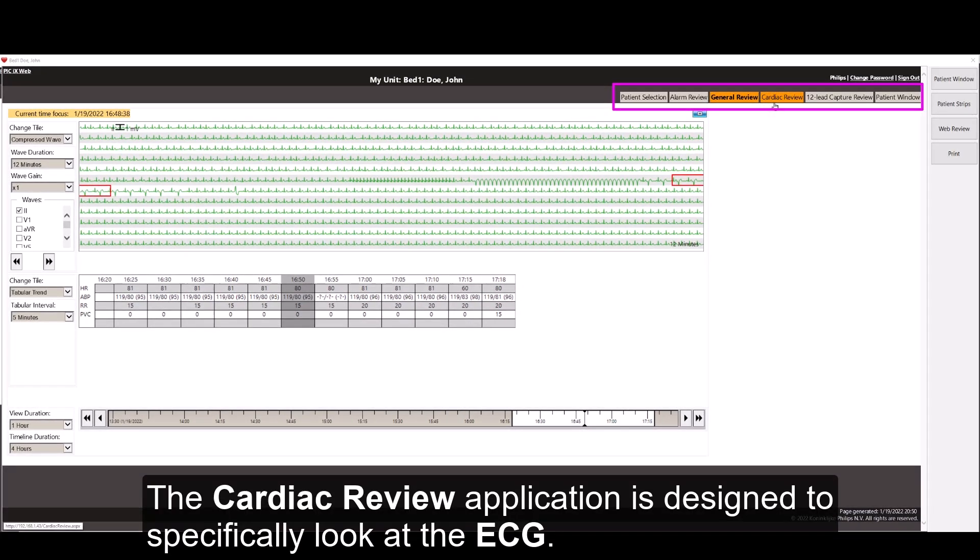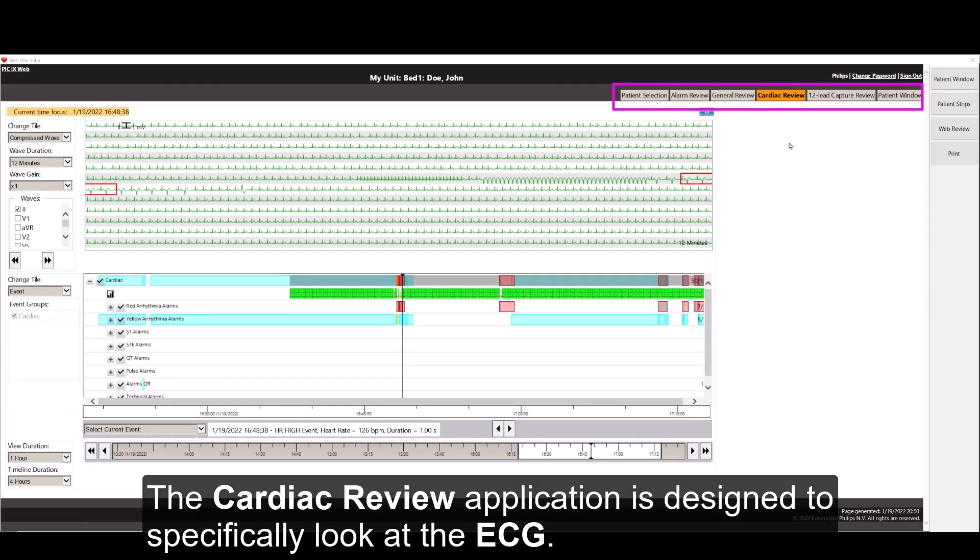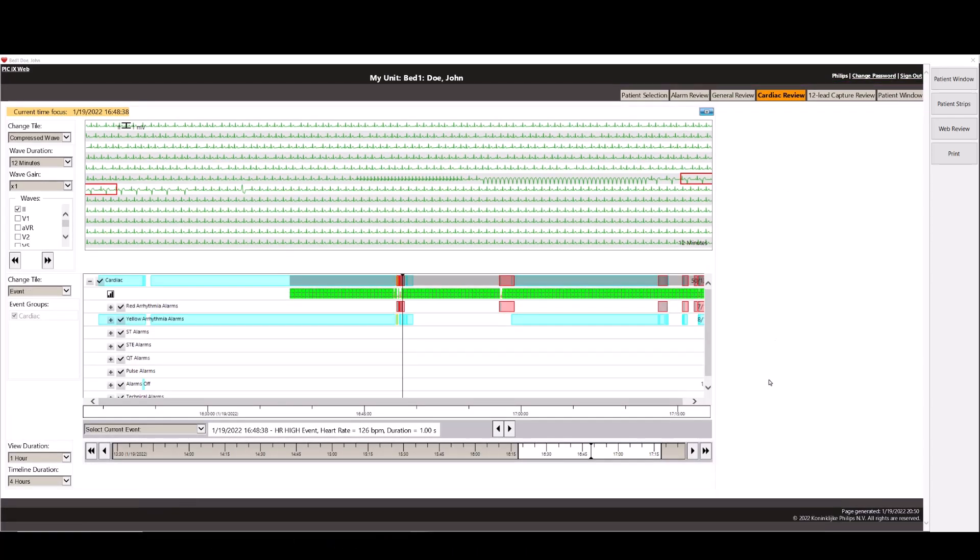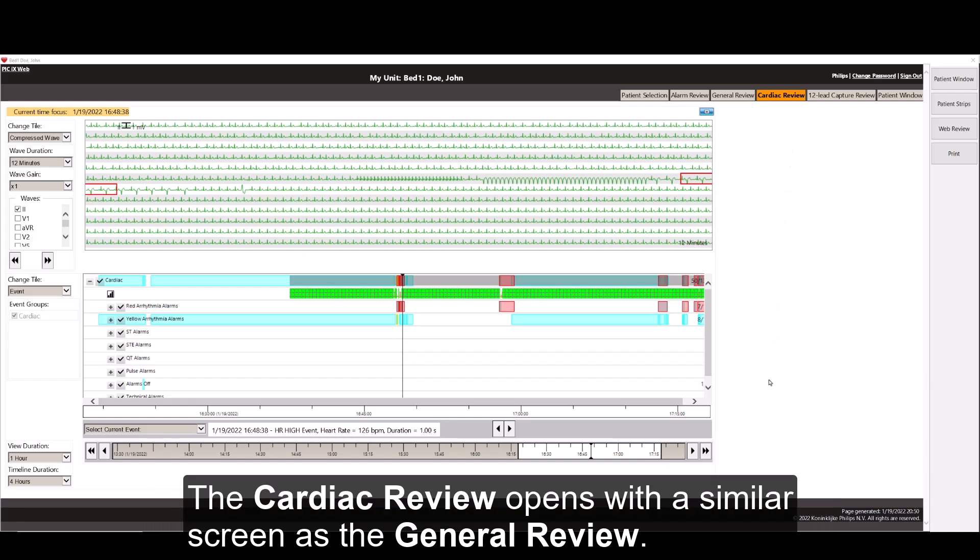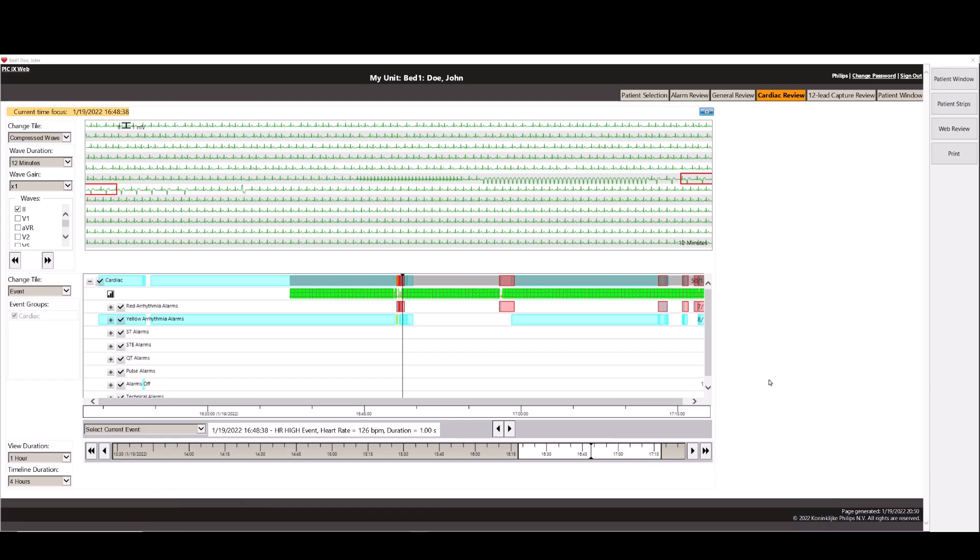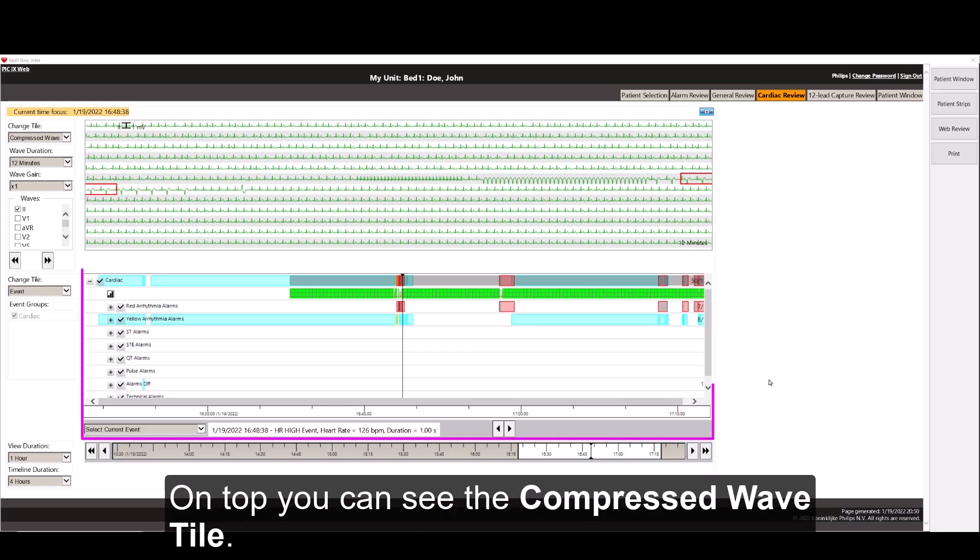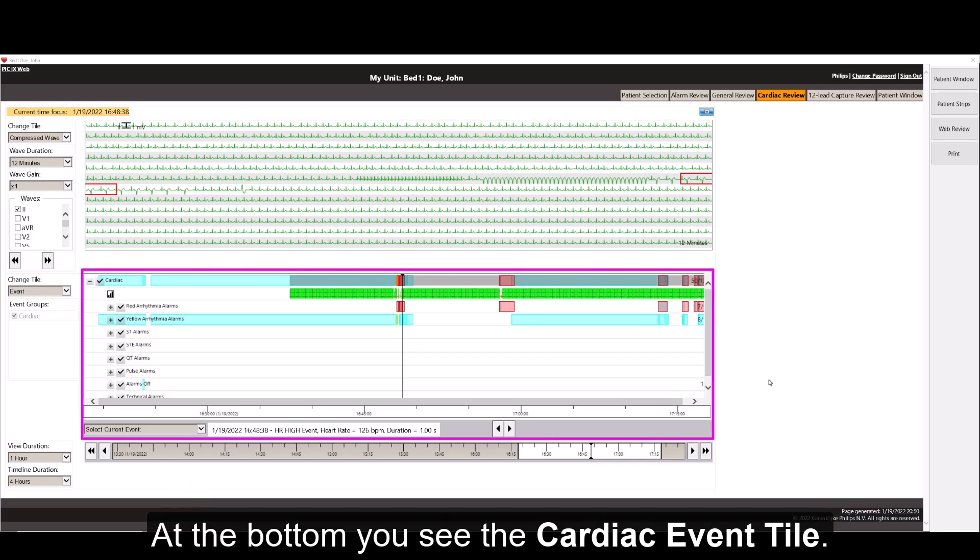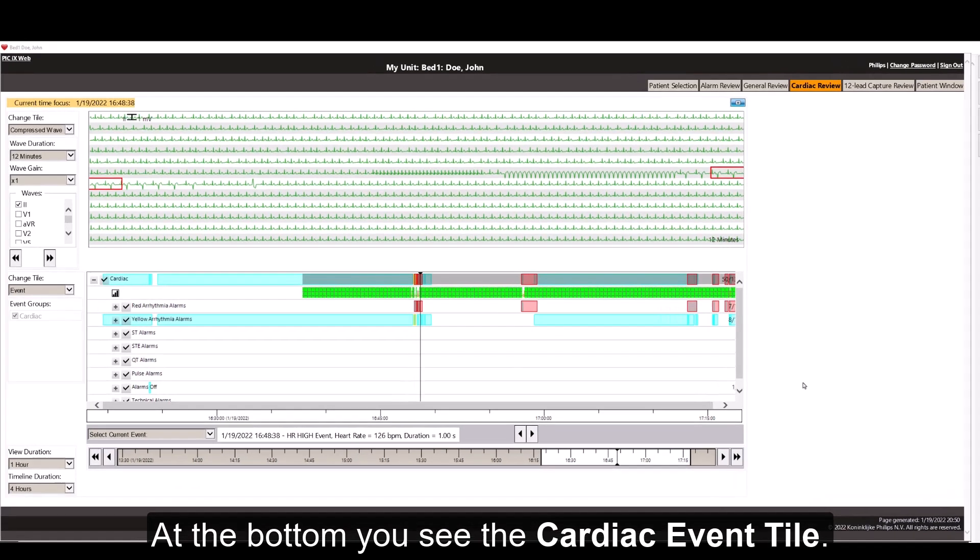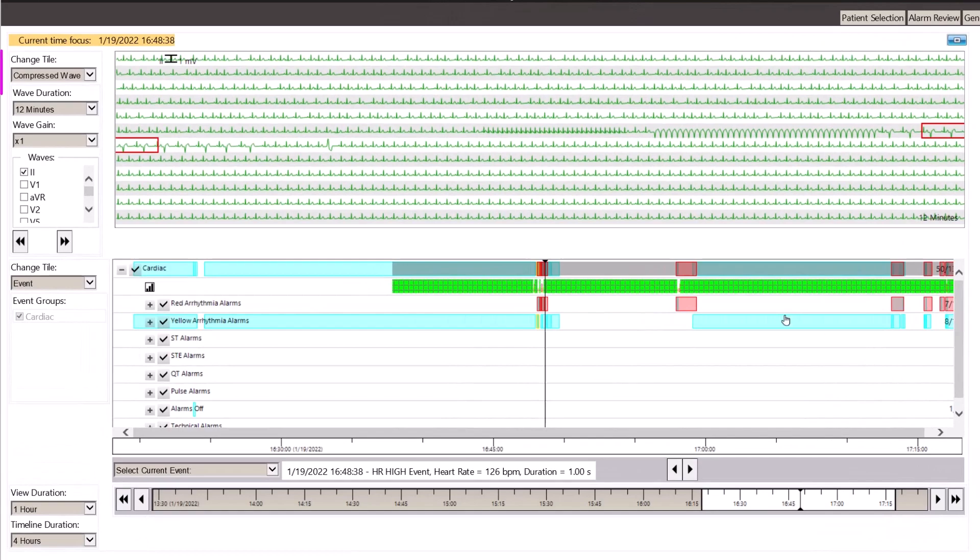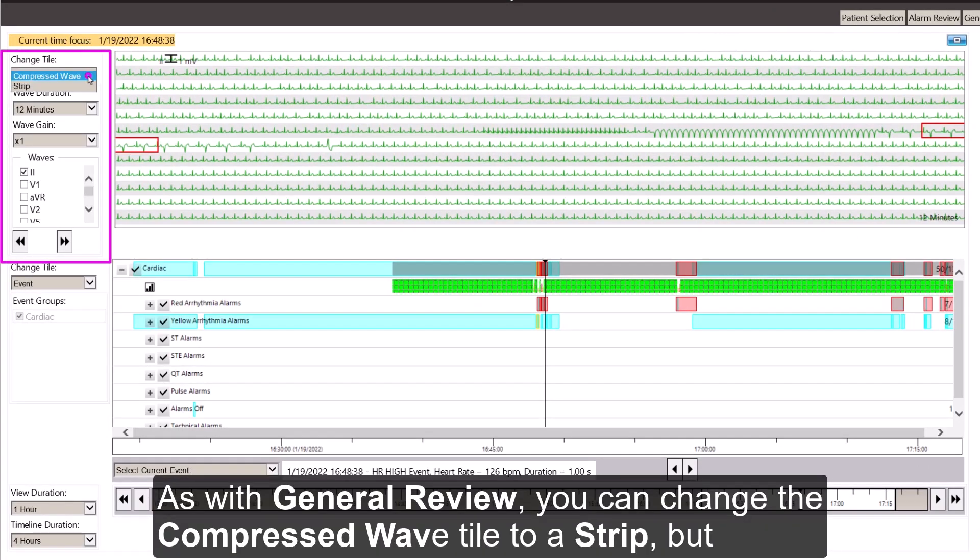The Cardiac Review application is designed to specifically look at the ECG. The Cardiac Review opens with a similar screen as the General Review. On top, you can see the Compressed Wave tile. At the bottom, you see the Cardiac Event tile. As with General Review, you can change the Compressed Wave tile to a strip.